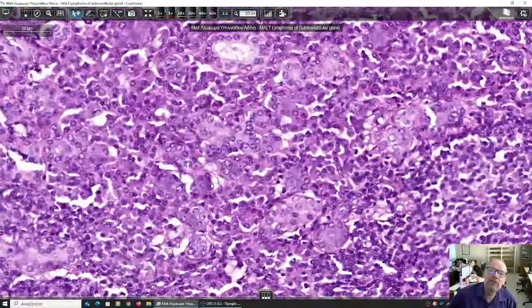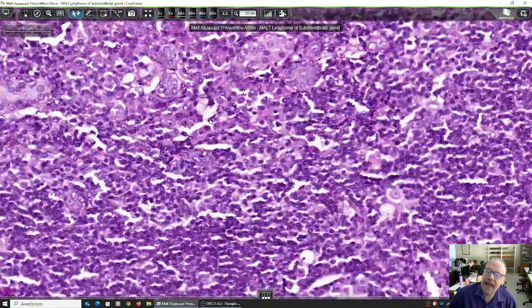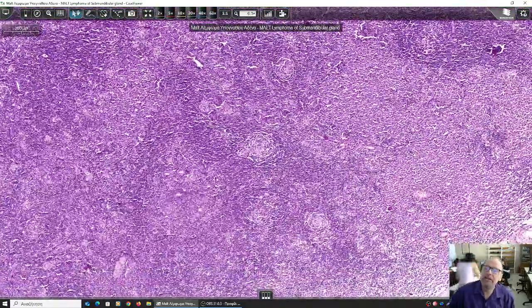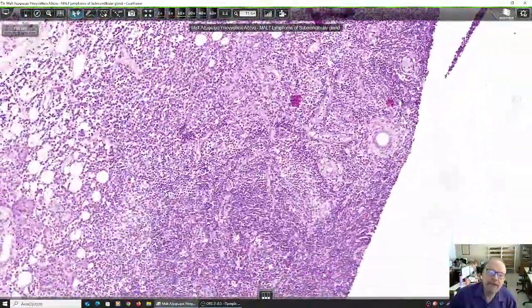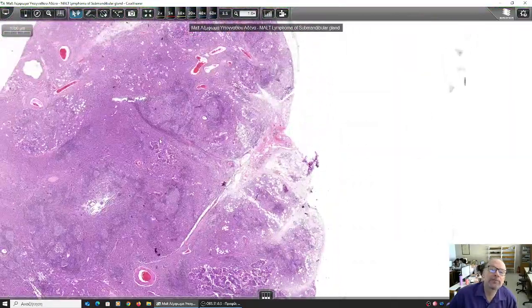So, when we see such lymphoepithelial lesions, you see how the lymphocytic component is admixed and enters the epithelial cells, the glands. Here we have the plasmacytic component. Here we have the lymphocytic component. In any case, if we see lymphoepithelial lesions, we have to examine the clonality of the lymphocytic population.